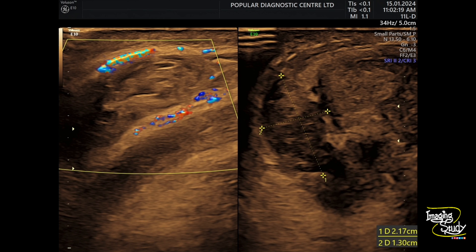On color Doppler, there was no internal vascularity within this lesion, and surrounding vascularity is slightly increased due to the inflammatory process.